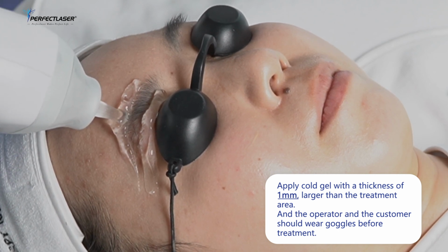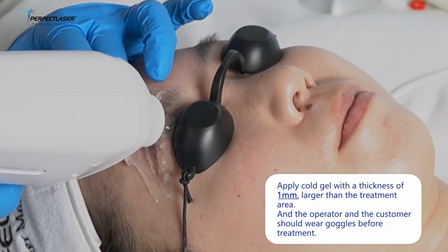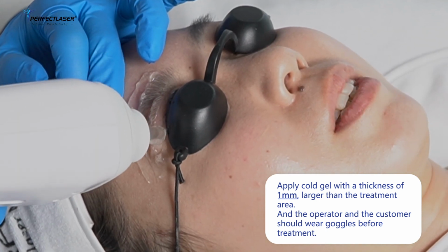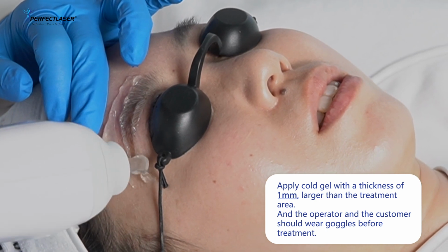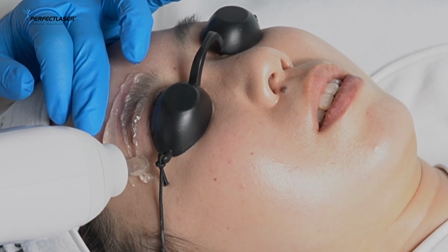The clinical endpoint can basically be reached within 50 seconds for unilateral eyebrow treatment. Clinical endpoint judgment: the skin is slightly red, hot from the inside out, and some hair can be gently pulled out. After the treatment, clean the skin.